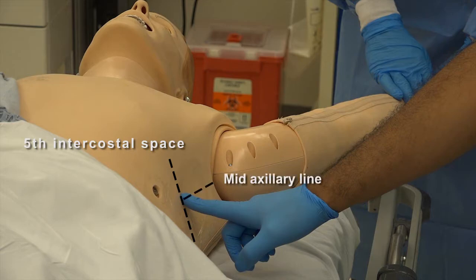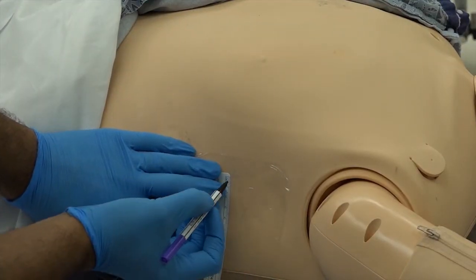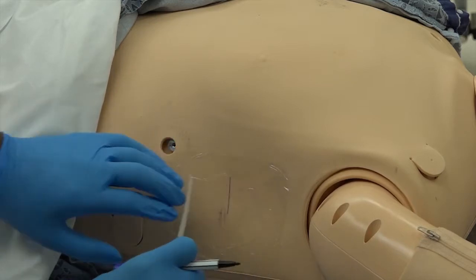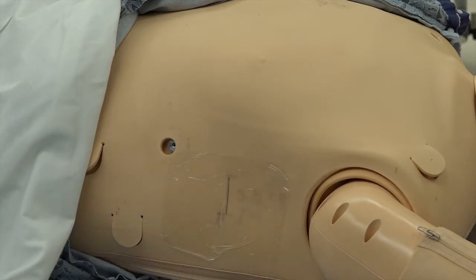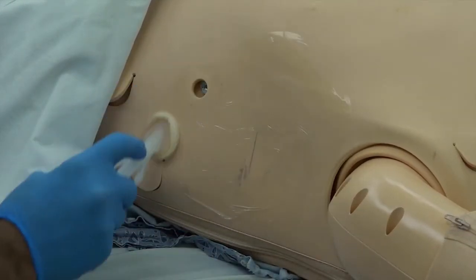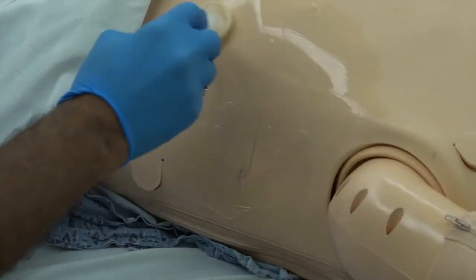and the mid-axillary line. Mark this point with a non-sterile marking pen. This site should be confirmed by the supervising physician and should be no longer than 3.5 centimeters or 1.5 inches. Next, sterilize the lateral chest wall with either a betadine or chlorhexidine-based prep.